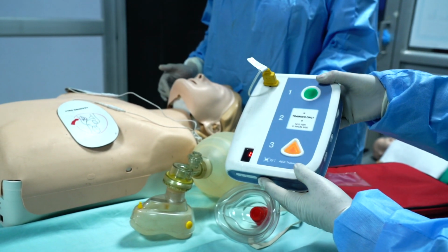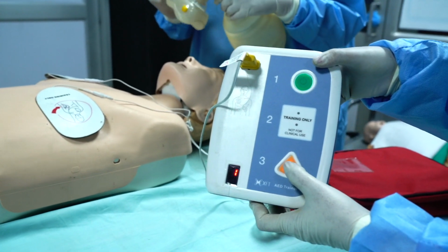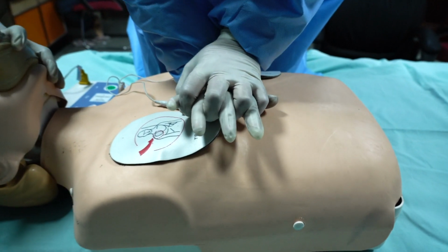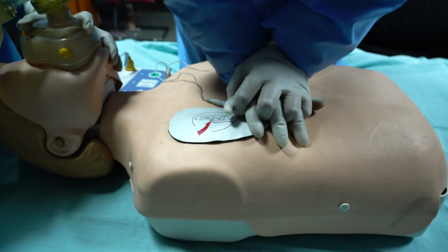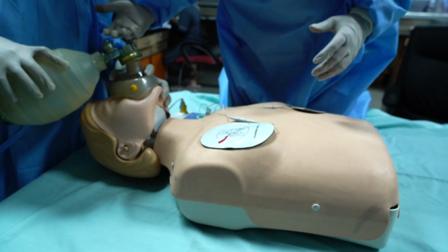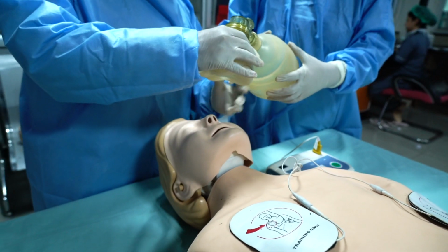Now the AED is commanding to press the shock button. We will press the shock button. Shock delivered. Now the same interchange again. We will start the chest compression and continue 30 chest compressions. After 30 chest compressions, the second person will give the 2 breaths with the help of the ambu bag. Ventilation with the ambu bag.